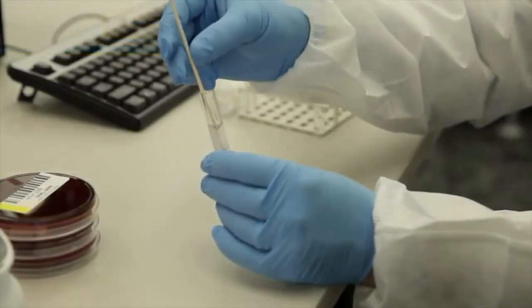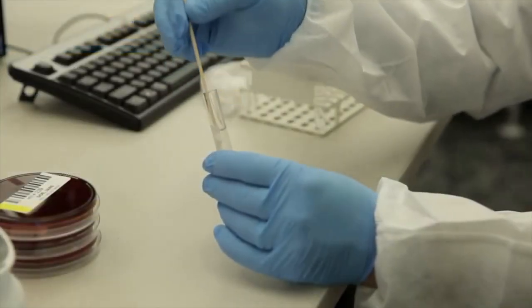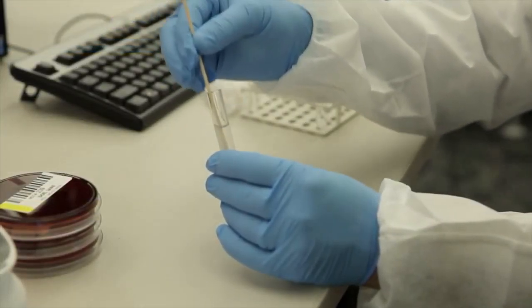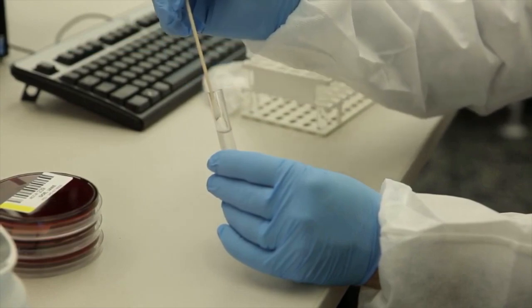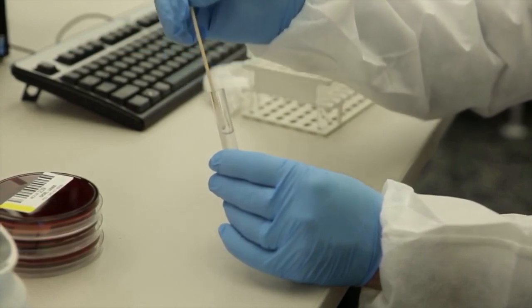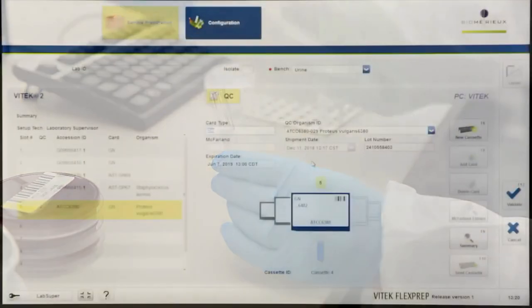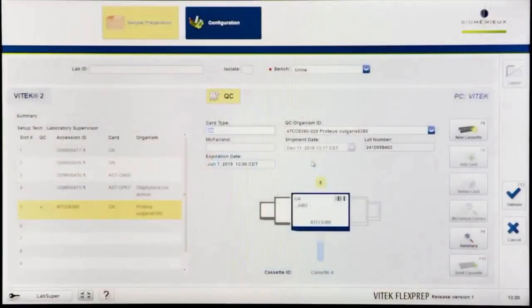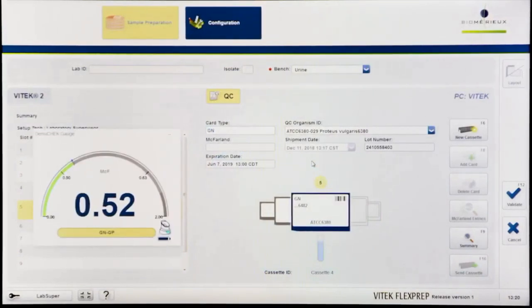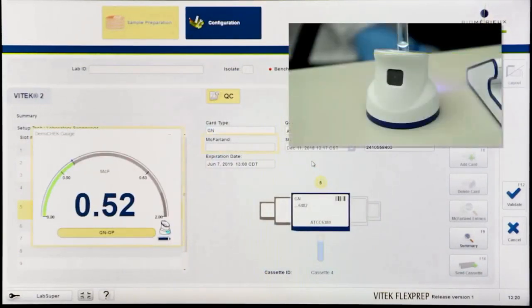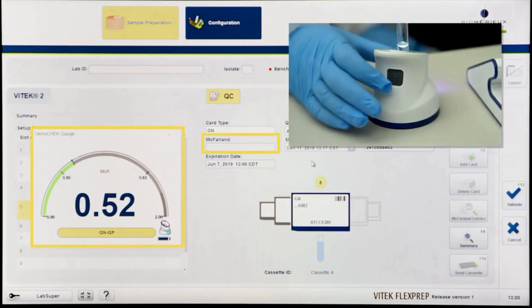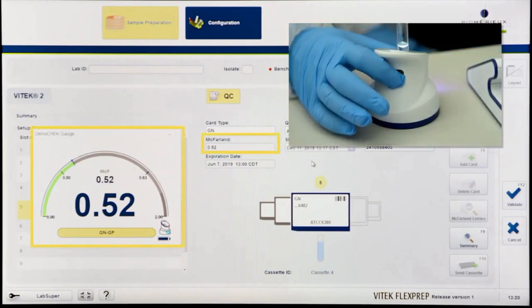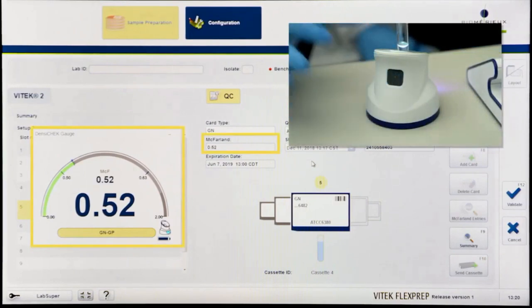Prepare the organism's suspension using well-isolated colonies of an appropriate age from an appropriate media. The Vitek Densa check will indicate if the suspension is of the correct turbidity or requires adjustment. Press the button on the back of the pod to transfer the accepted McFarlane value onto Vitek FlexPrep.